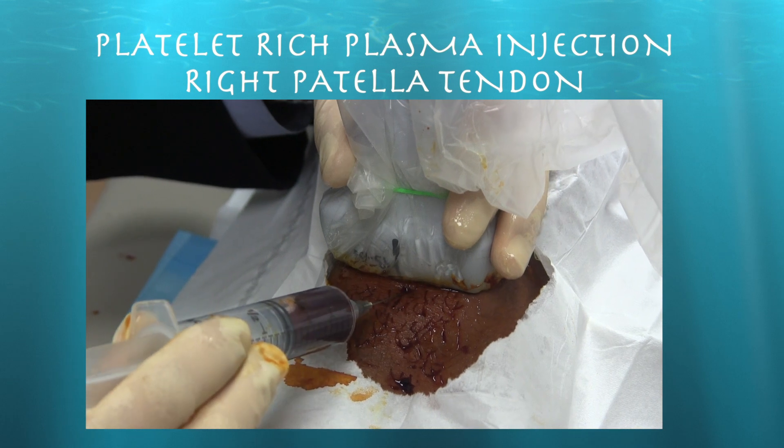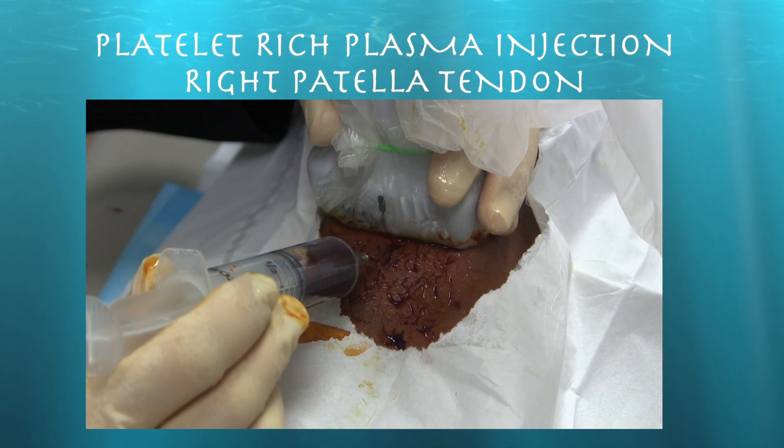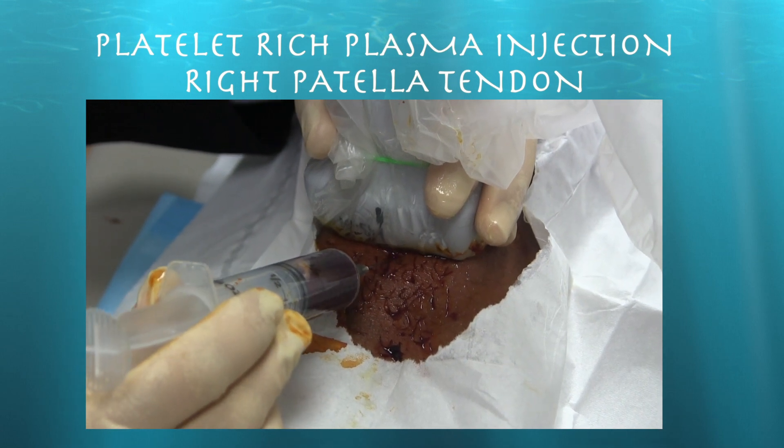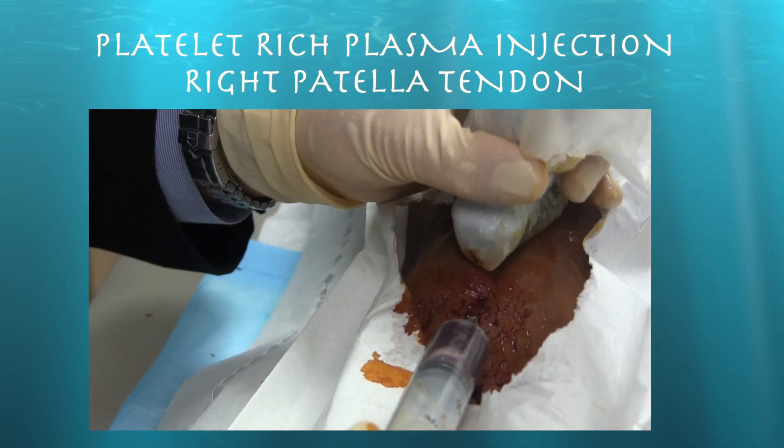Here we are doing basically a tenotomy. We don't have ultrasound images to accompany it, but you essentially get the sense of what we're doing — we're just going in and out with the needle into the tendon to try to elicit a healing response.